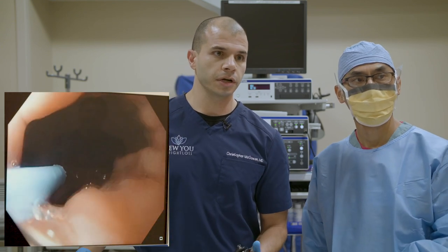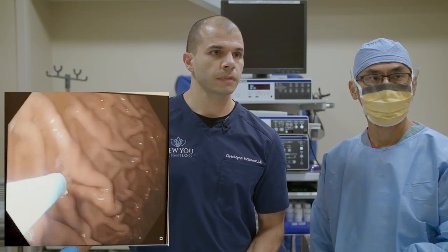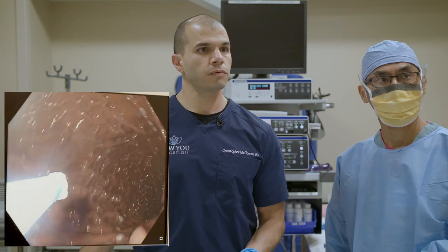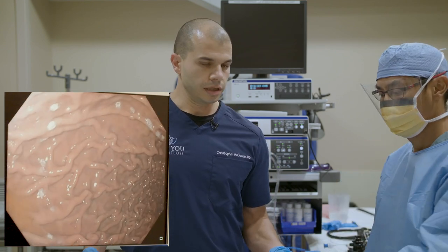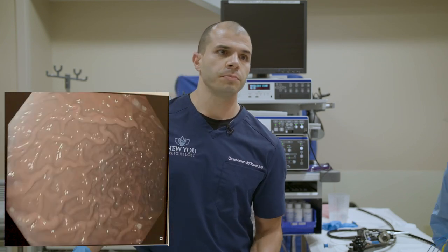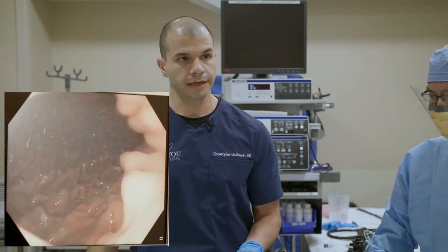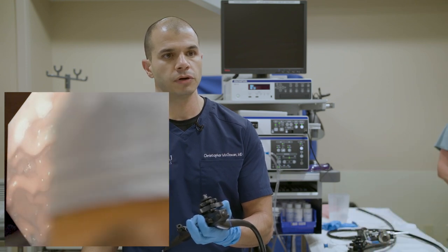I like to make a third line up at the esophagus-stomach junction — the upper boundary of our suturing. Above this line, the top of the stomach, where the fundus is located, has a wall about 50% thinner than the rest, and adjacent structures like the spleen, lungs, and diaphragm are nearby, so we stay clear of that. We've marked the stomach and we're now switching to our suturing scope — the overstitch setup.